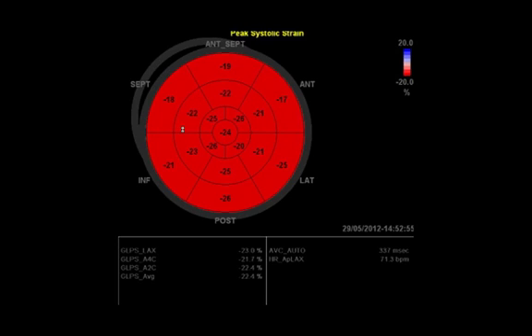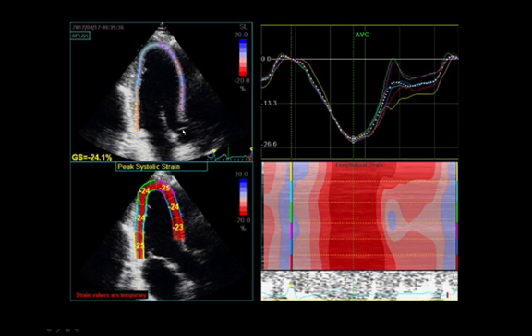base. That was well seen in the graph that I showed first, where the normal values were defined, separated by apex, base, and mid, and you can tell that the apex always in the normal population carries higher numbers. And it's very important to keep in mind in this representation.